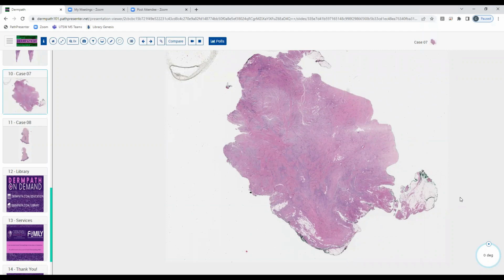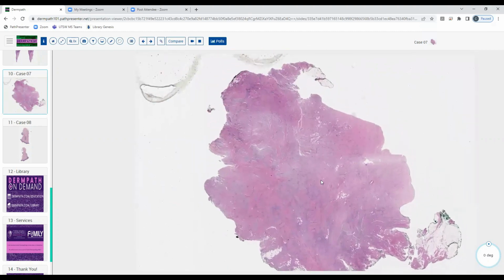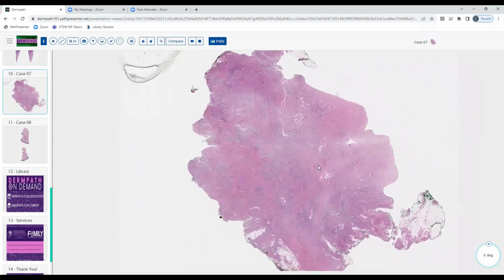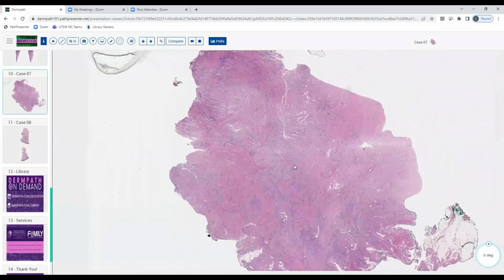Great. So right off the bat, this looks like an excision. And looking at it, I didn't see an epidermis. And yeah, it might be one of these enucleations again. It might have been something deep in the skin, and they said, let's just try to cut this out like a cyst, and surprise, surprise, it's not a cyst. Yeah, that was another thought, since there was no epidermis, possibly an enucleation. And then it looked very spindly, so lots of spindle cells. There's some fat cells scattered throughout.